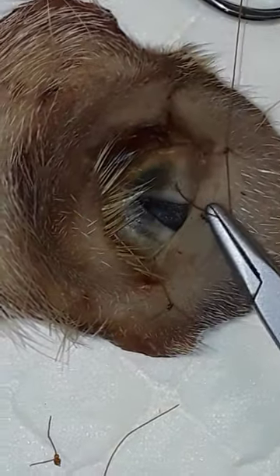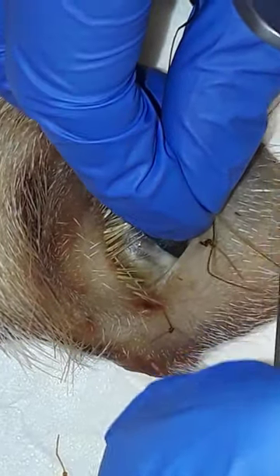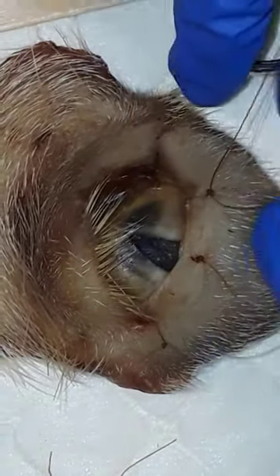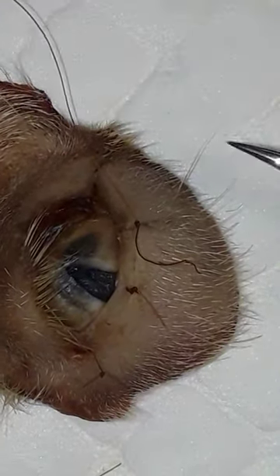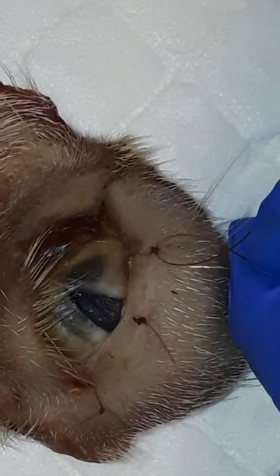I'll close this as I normally would with about four throws. I can either cut the tags really short, or keep them long and finish by closing the remaining part of the defect with simple interrupted sutures below the eyelid — probably only one or two below this suture. Once I place those, I can incorporate the tags into the knots so they're pointed away from the eyelid margin if I keep them long. So you have a couple of options, and we'll walk around and help you through them.